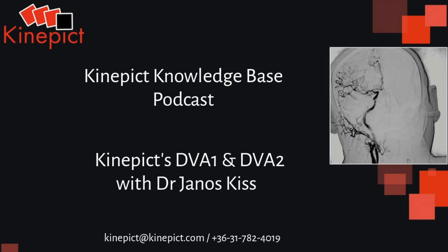Now, in the case of DVA2, we use a similar basis, and we actually use the DVA1 image for the basis, but after that we use a more complicated algorithm which calculates not only the single pixel images, but takes into consideration the images around the single pixel, which means that we can get a kind of smooth picture or image. And also we can apply different noise filters.